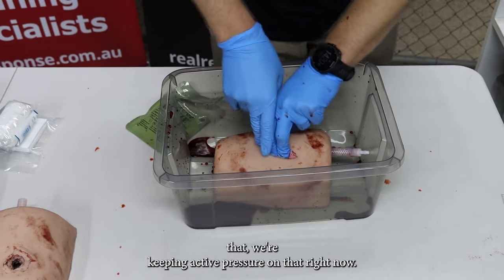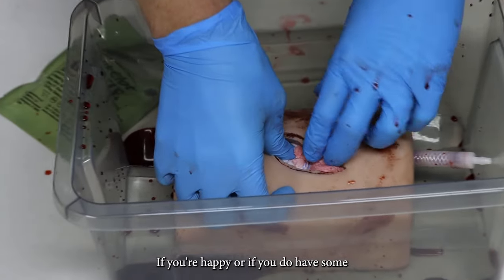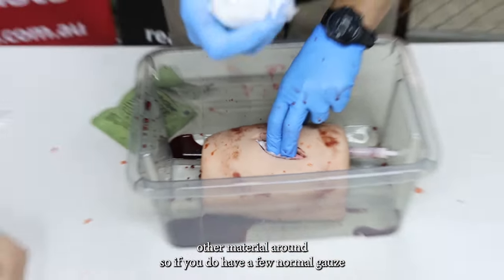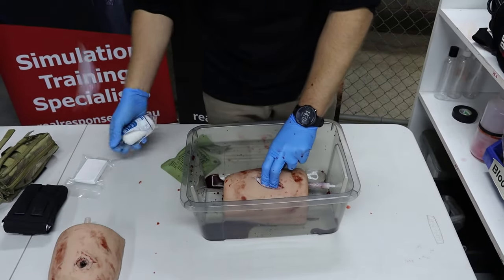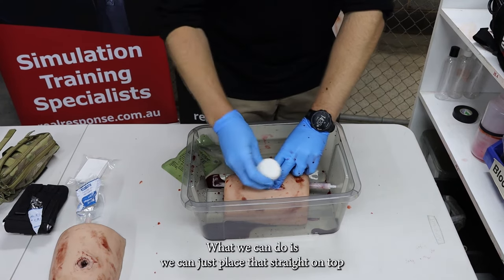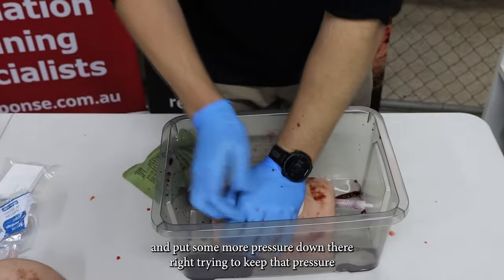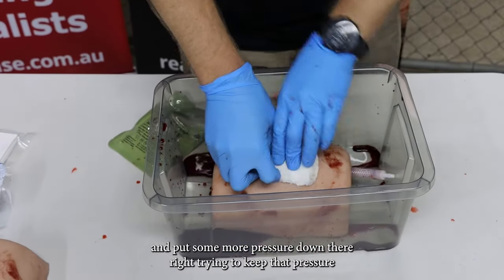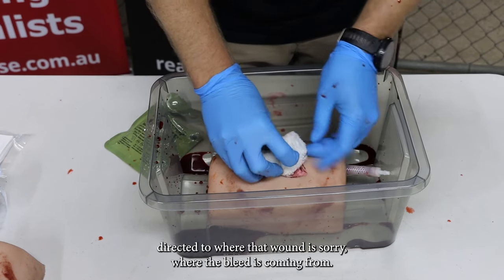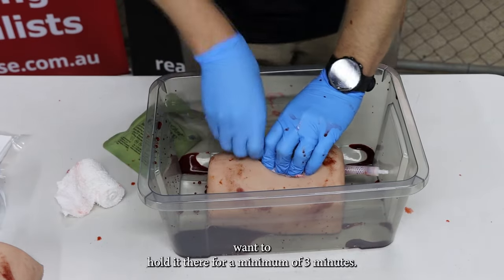Once you've done that, we're keeping active pressure on there. Now if you do have some other material around — a normal gauze — just open it up. You don't need to take the bandage out. We can just place that straight on top and put some more pressure down there, trying to keep that pressure directed to where that bleed is coming from. We want to hold it there for a minimum of three minutes.